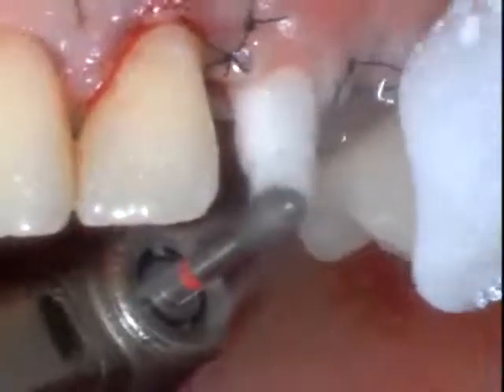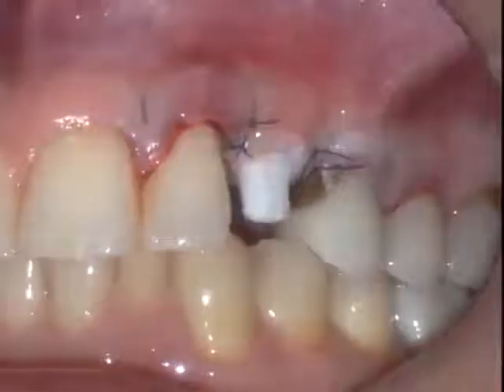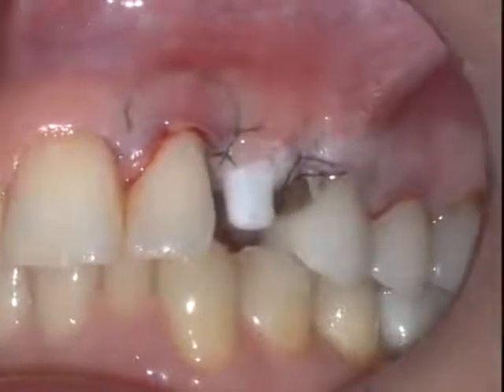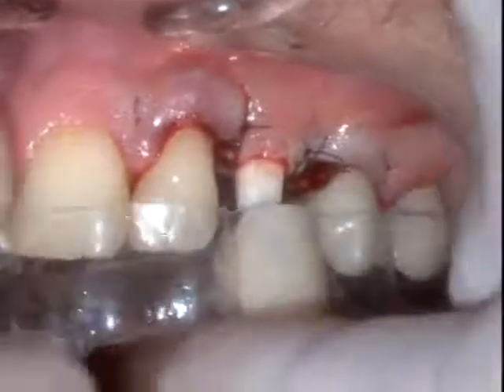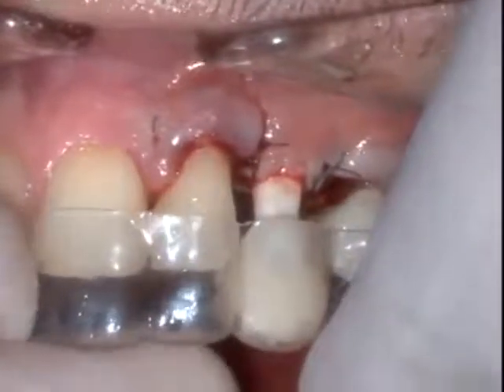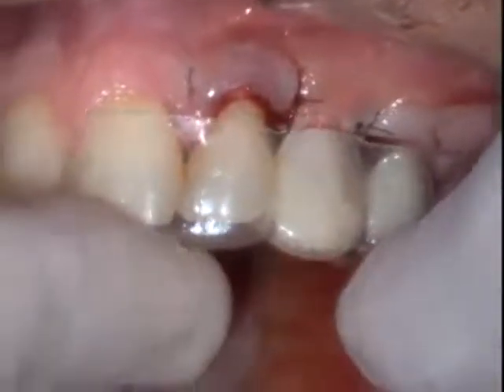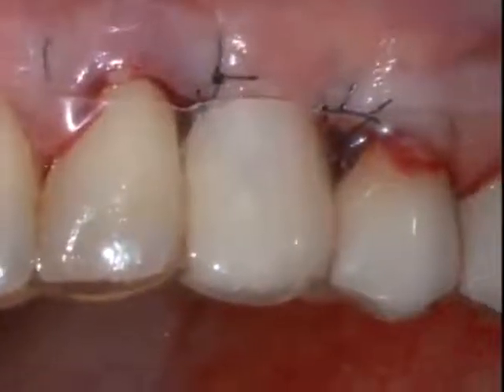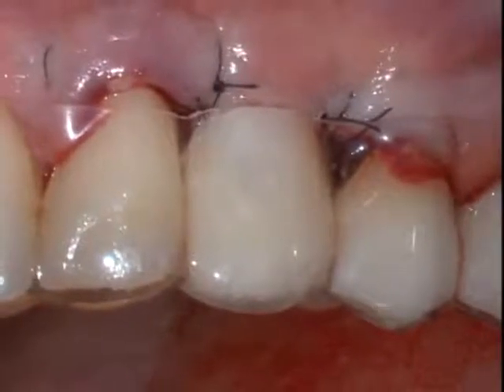It's very important that there is no contact between the underside of the implant abutment and the Essex retainer. We reduced the adapter on the abutment. This was utilized to ratchet down the implant. And then the reduction allows us now good occlusal clearance for future tooth replacement, and also to make sure that there is no early contact with the hollowed out provisional tooth in the Essex retainer.